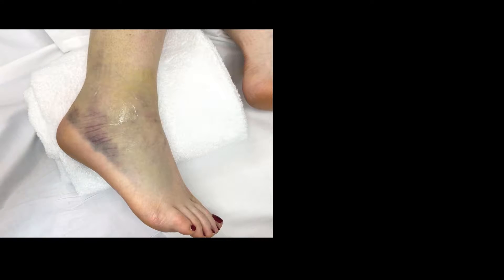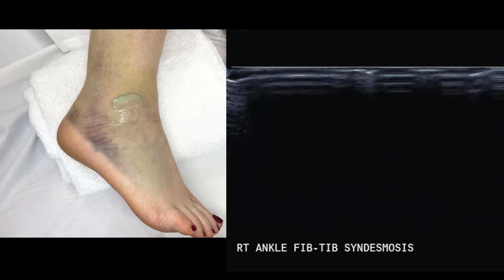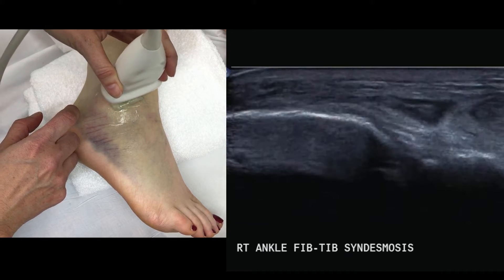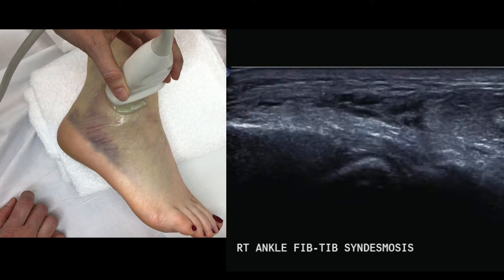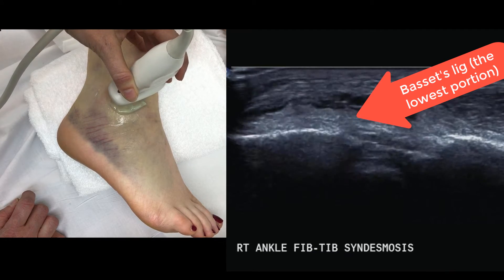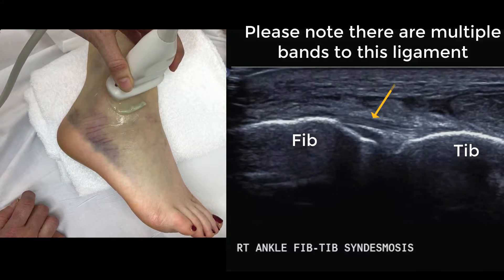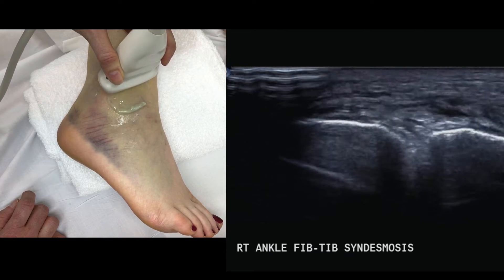Starting the assessment for syndesmotic injuries — a high ankle sprain. The angle needed is about 45 degrees upward from the lateral malleolus. Palpate the lateral malleolus and angle the probe accordingly. You need to be above the ankle joint; if you're too low you'll just see the talus. Slide the probe superiorly to find the syndesmotic ligament, then heel and toe the probe so the ligament is horizontal on screen. There are multiple bands, so scan both inferior and superior to them.